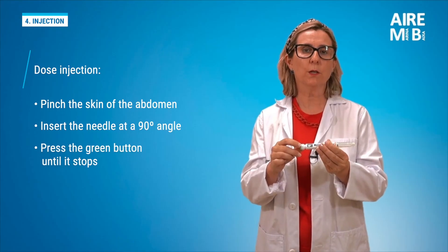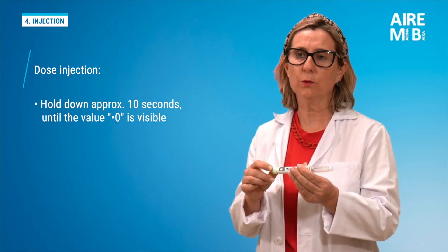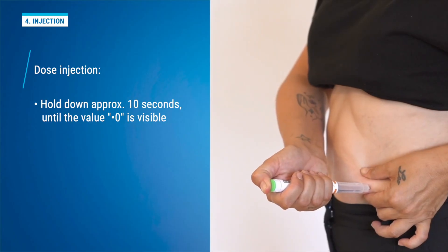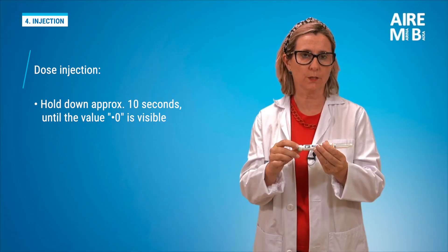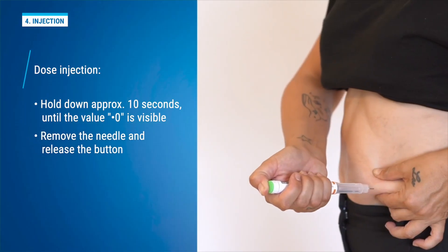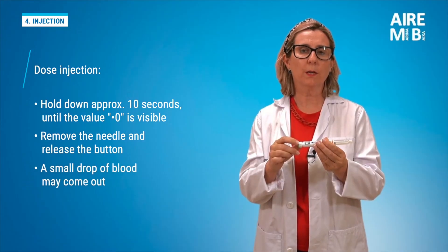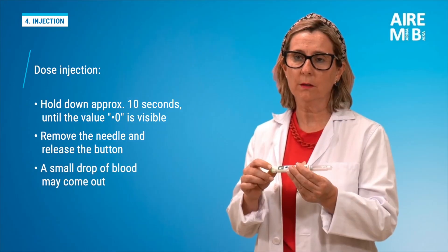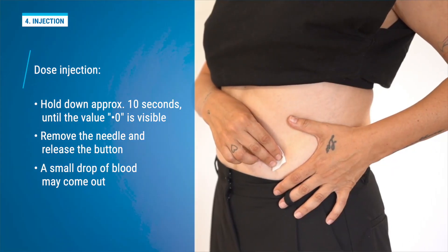We press the green injection button until it stops. We keep it pressed for a few seconds and count slowly until it shows zero, which takes about 10 seconds. Next, we carefully remove the needle from the skin and gently release the button. A small drop of blood may come out at the end. If necessary, we can apply pressure to the area, but we should never rub the injection site.